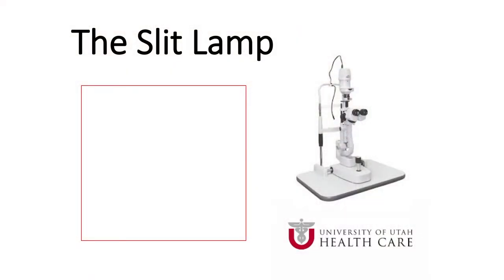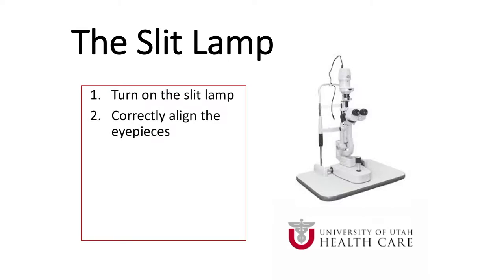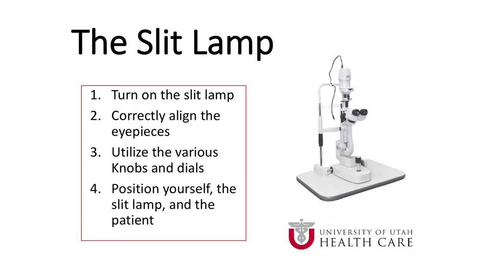First we will give a brief overview of the slit lamp, which is an instrument consisting of a high-intensity light source that can be focused to shine a thin sheet of light onto the eye. We will first show you how to turn on the slit lamp, how to correctly align the eyepieces, and how to utilize the various knobs and dials. Finally we will show you how to position yourself, the slit lamp, and the patient comfortably.